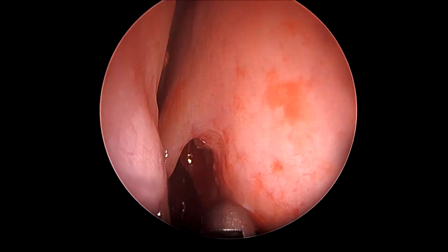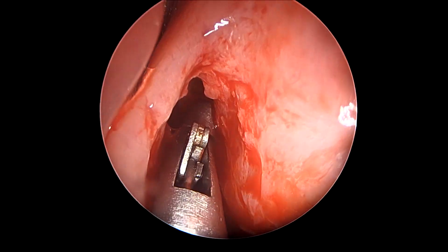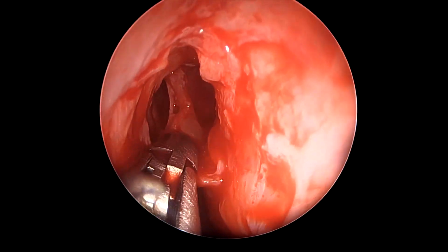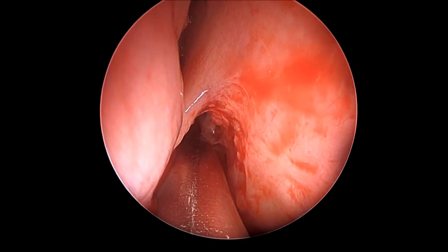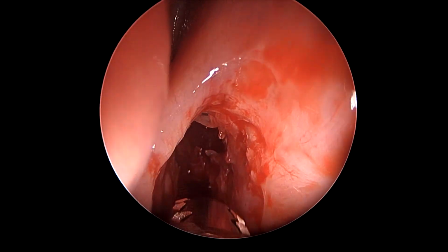Once this cell has been loosened and fractured, we can resort to a giraffe forceps, which is appropriately angled, to grasp the wall of this supra bulla cell and clear this off to create a straightforward opening inside the frontal sinus.